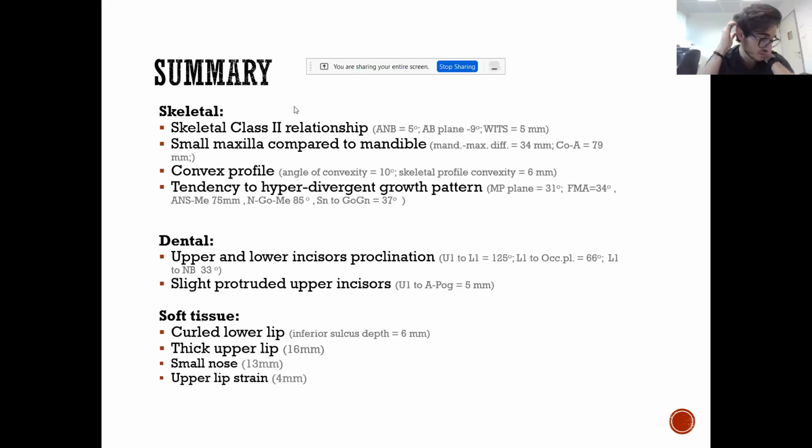I think it's 13, 14. Because it's not my case, but I think it's between 13 or 14. Okay. So for you, it's a high angle. You have to write here, it's a high angle case with a hyperdivergent pattern. Okay, mm-hmm.